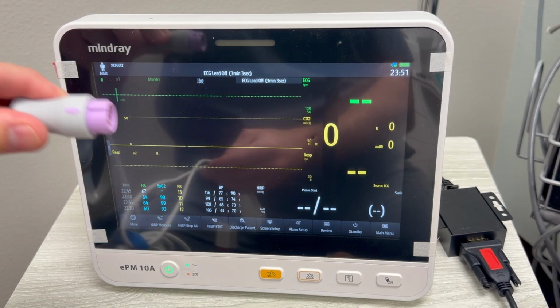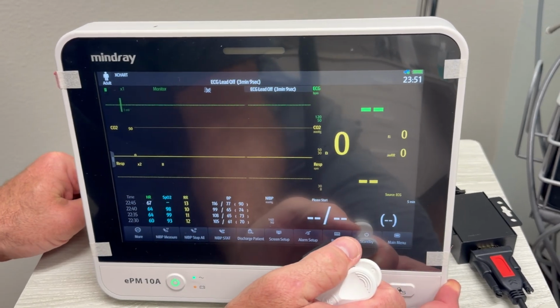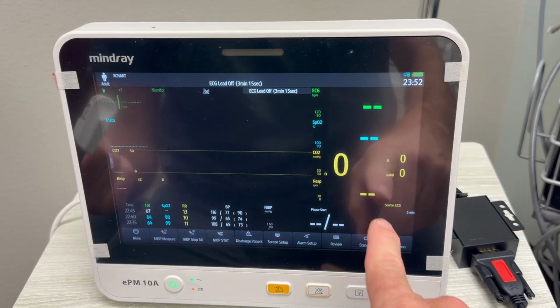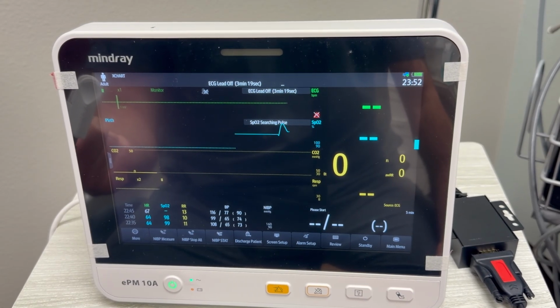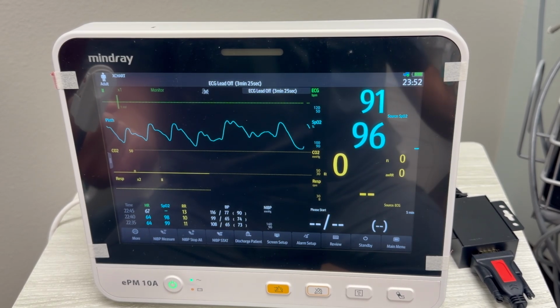And here you can see I've got the little adapter for the SpO2, and I'm going to plug it in over here. And then I'm going to put it on my finger, so that it'll start getting some data, and once it does, it'll somewhat wake up. And then when you go to search for it on a driver through the computer system, it'll actually recognize it.